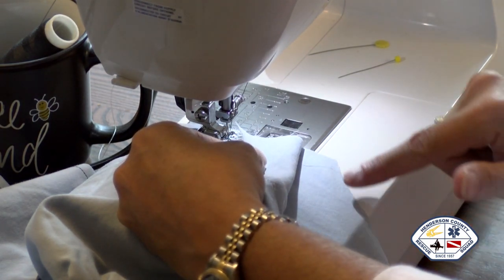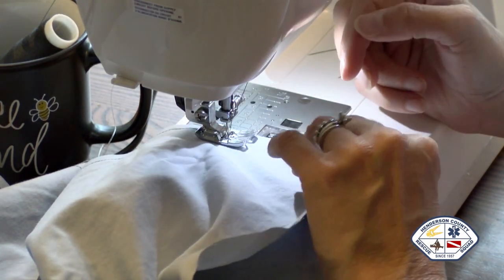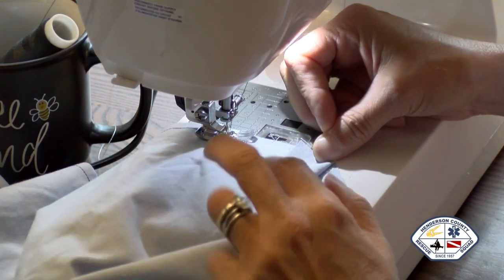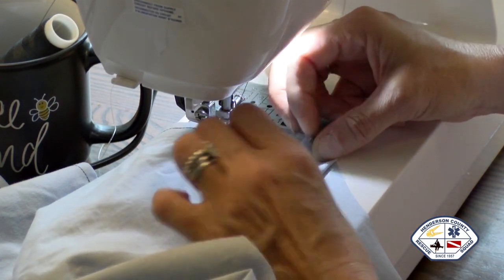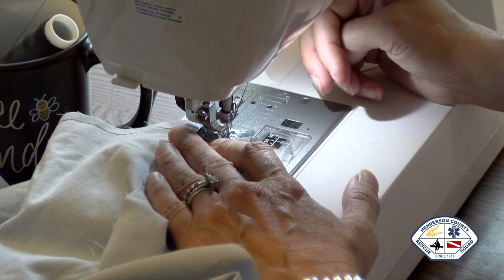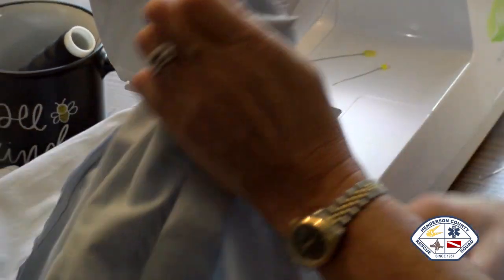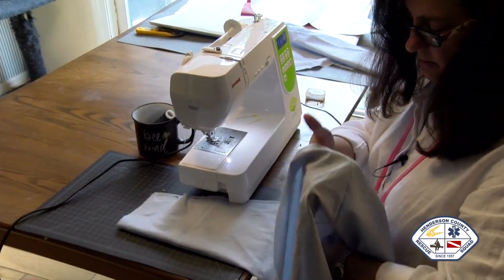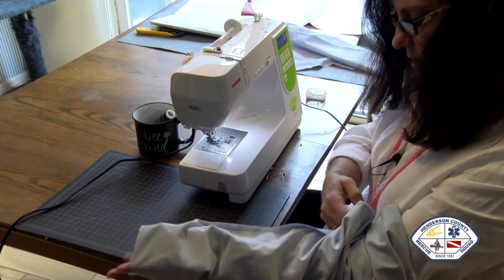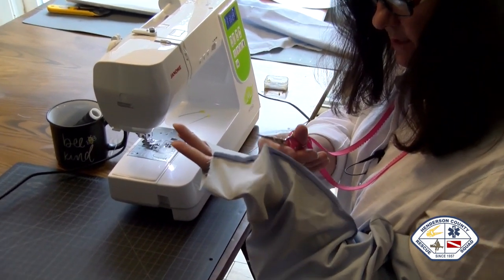Okay, here is my neck seam, right? We've cut that out. This is going to be the back of the gown. That's not right. We're going to fold it over. We're going to sew to the edge, and knot it, and cut it. This is my favorite part, and it cuts on the bottom. Okay. Now, let's take my pins off. Now, we've got our little hole for a thumb right here. We'll snip those threads. One side is white, one side is black for me.